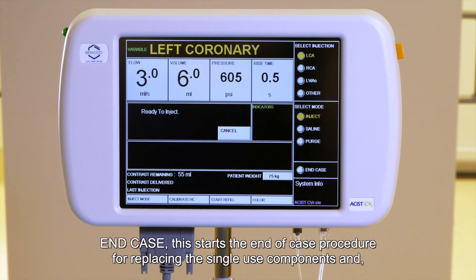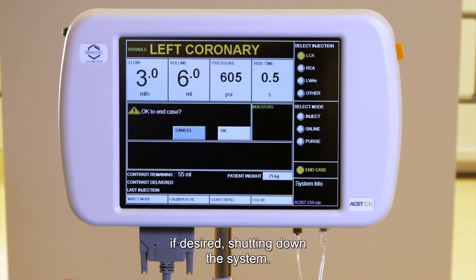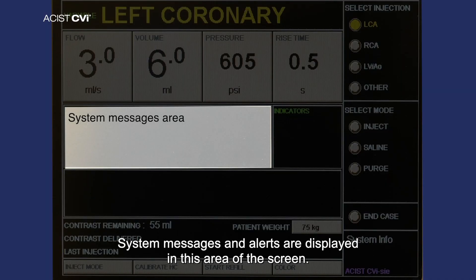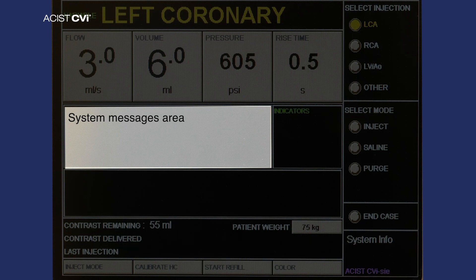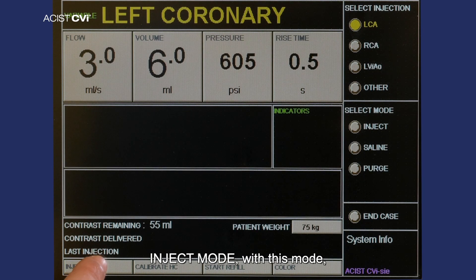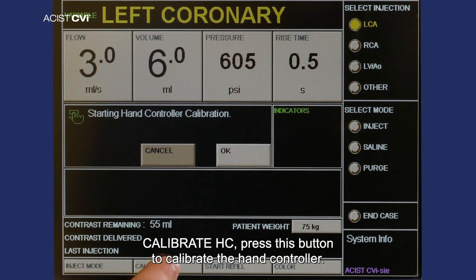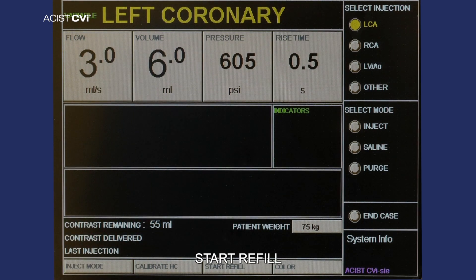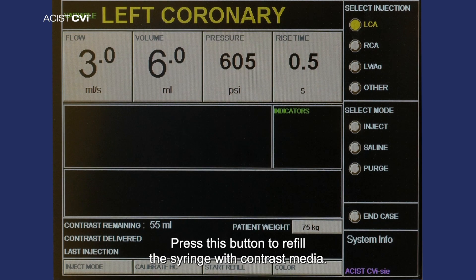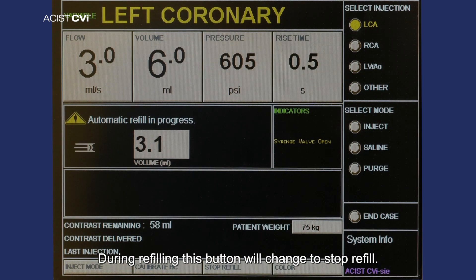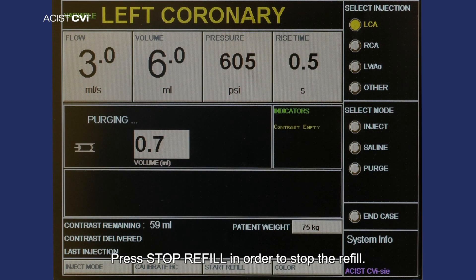End case: this starts the end of case procedure for replacing the single-use components and, if desired, shutting down the system. System messages area: system messages and alerts are displayed in this area of the screen. Inject mode: with this mode you can switch between variable and fixed flow rate. Calibrate HC: press this button to calibrate the hand controller. Start refill: press this button to refill the syringe with contrast media. During refilling, this button will change to stop refill; press stop refill in order to stop the refill.